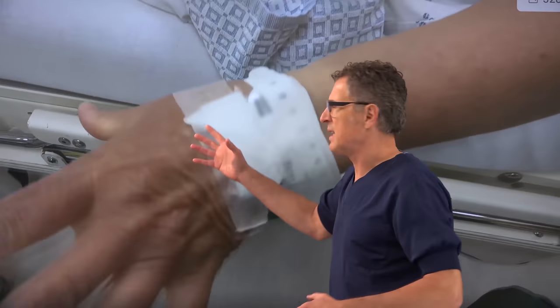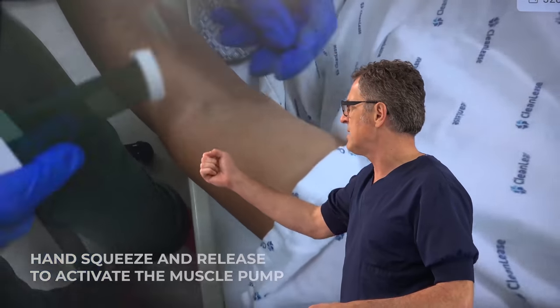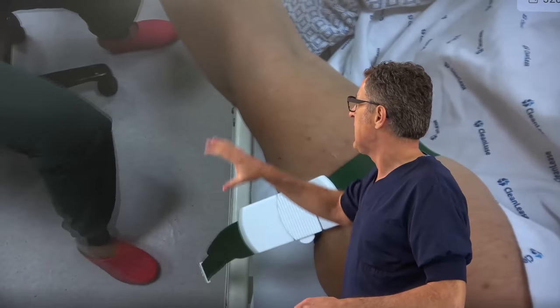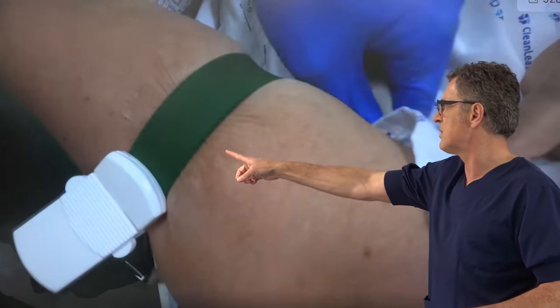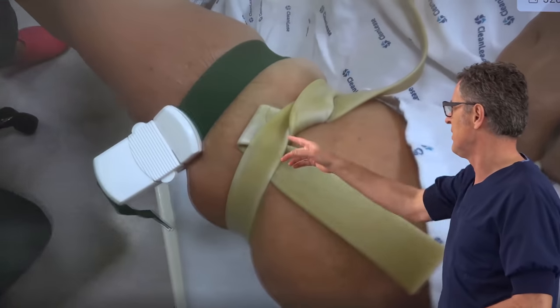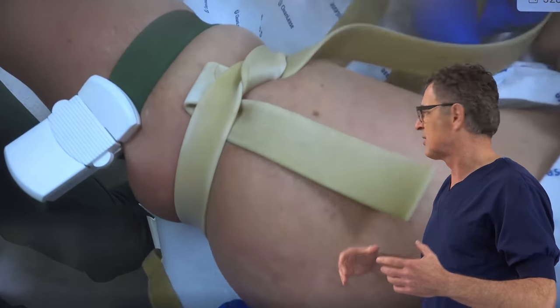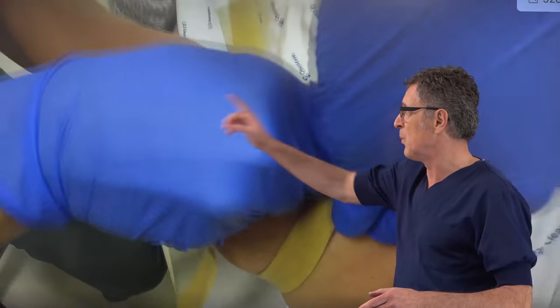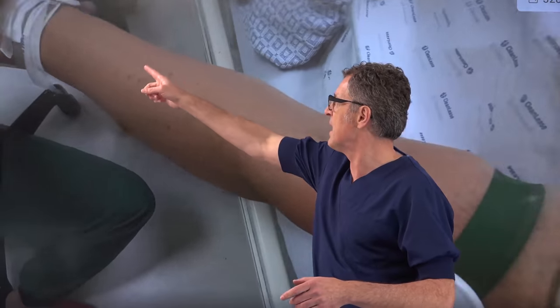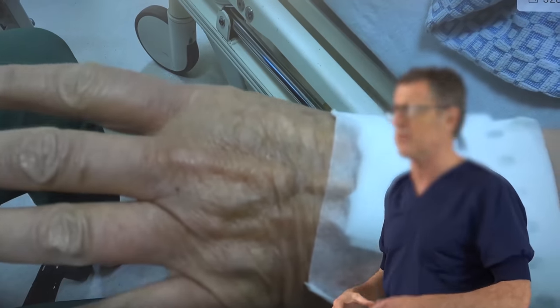Here we have a patient performing a muscle pump maneuver — pumping of the hand forces blood by contracting muscles from the deep veins into the superficial veins. We have applied one tourniquet already, we are now applying the second tourniquet, and we are going to apply the third tourniquet. It looks a little bit grotesque; however, if one tourniquet is helpful, three will be more helpful. It is now very difficult for blood to travel centrally, so it stagnates and engorges the peripheral veins.